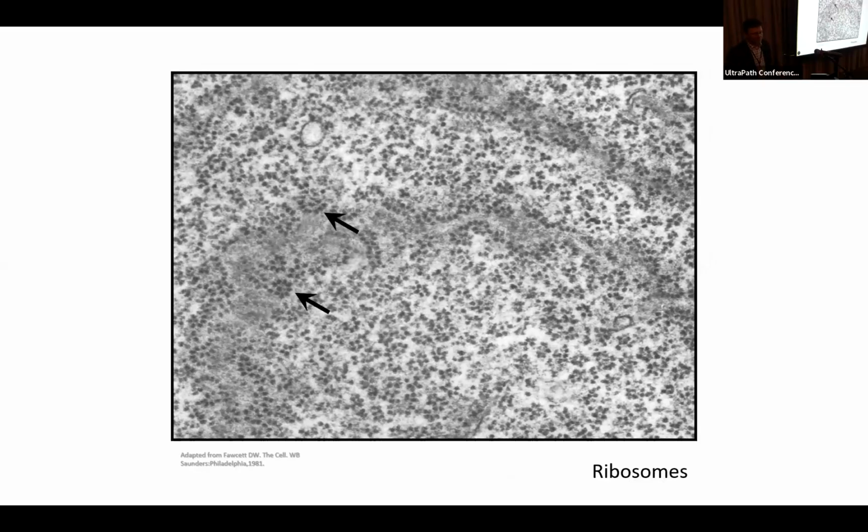Here we're looking at ribosomes. When they're not associated with the endoplasmic reticulum, they can be confused with glycogen particles, but they can, however, be distinguished from glycogen on the basis of their smaller size. They're a little bit smaller than glycogen particles, and the staining is usually a little bit more intense and uniform. And here you can see that it looks like they're forming kind of some spirals. This is really where they're just attached to the endoplasmic reticulum underneath them.